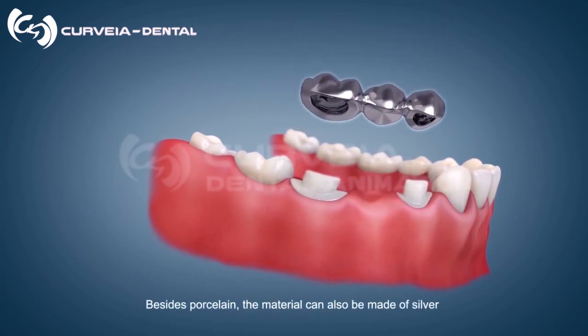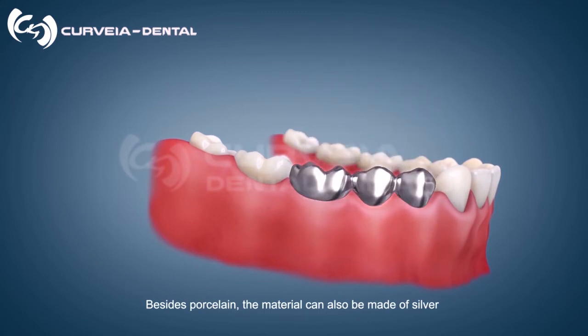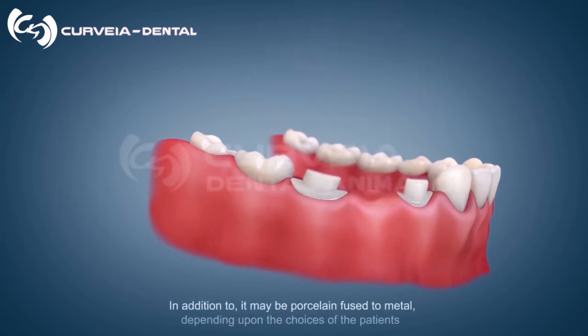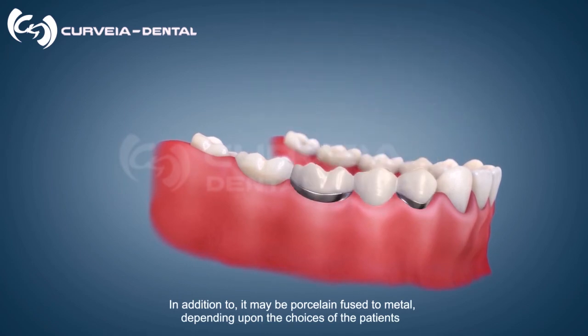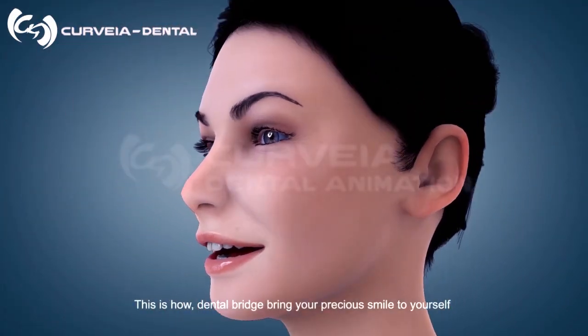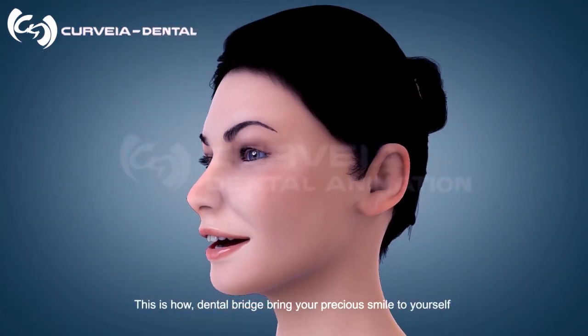Besides porcelain, the material can also be made of silver. In addition, it may be porcelain fused to metal, depending upon the choices of the patients. This is how a dental bridge brings your precious smile back to yourself.